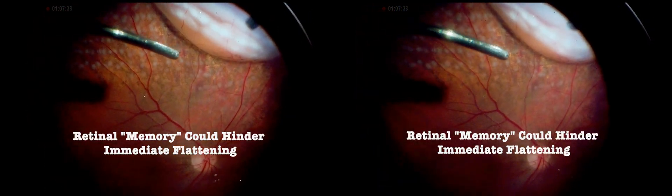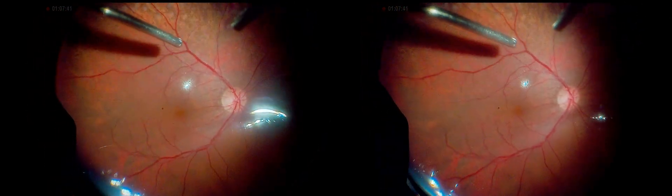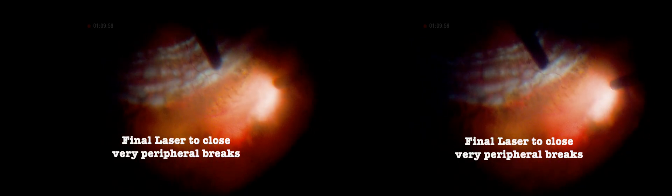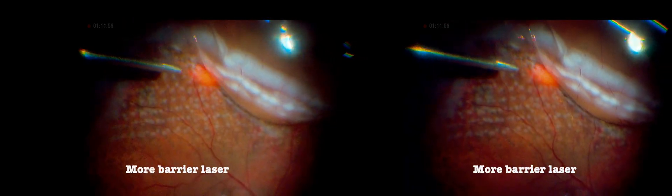Retinal memory from PVR can initially prevent immediate flattening, but this typically resolves, leading to full attachment in the post-operative days. It's crucial to remove any fluid from the far periphery, but always be mindful not to touch the lens. Additional laser is applied inferiorly where the retinotomy was created, since it was placed very peripherally and no residual fluid inside is desirable. Afterwards, another superior laser barrier is applied.